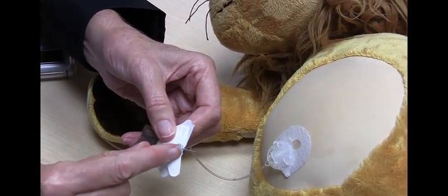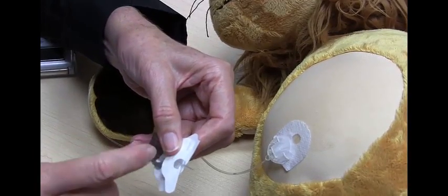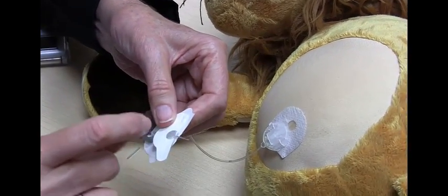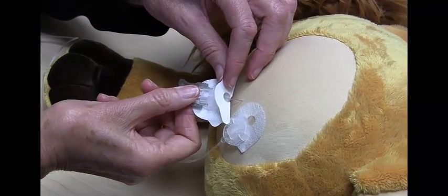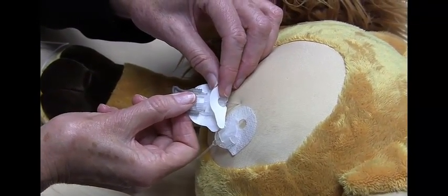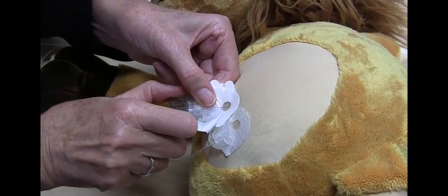And there is a needle here which is covered by the very small plastic tube which is going to remain in the skin. So for insertion we go in at an angle and then remove the needle.